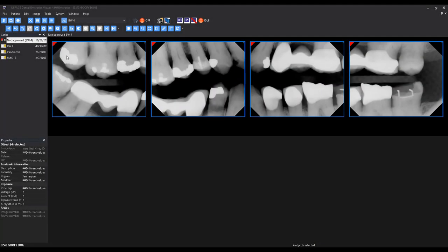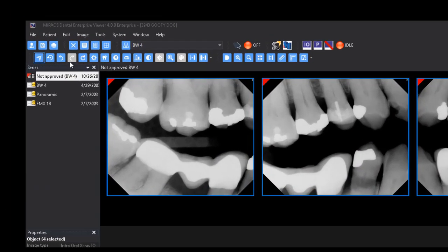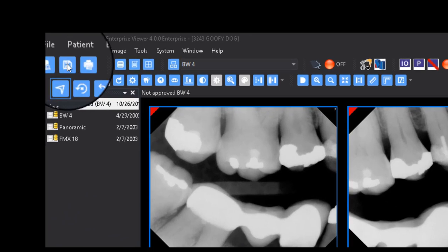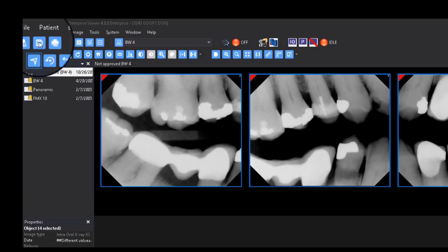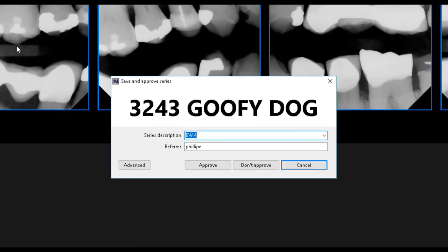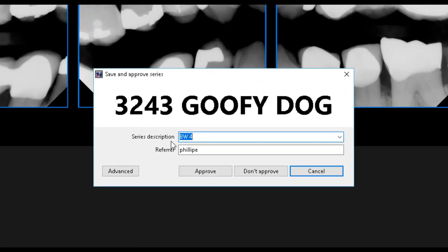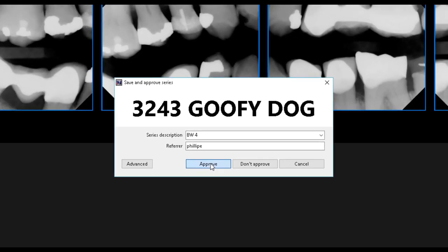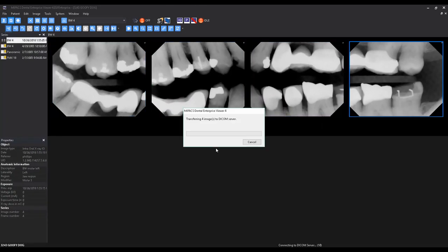Once a series is ready to be approved and stored to the DICOM server, click the Save button. Enter in a custom description if you would like, the referring physician, and click Approve. If a user with limited permissions is trying to approve the images, a prompt will appear requesting a user with approval rights to sign off on the series.